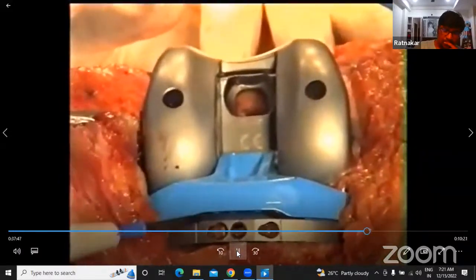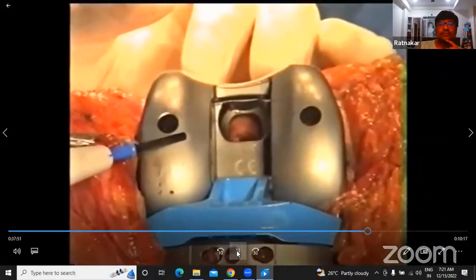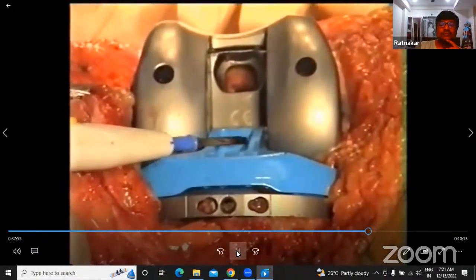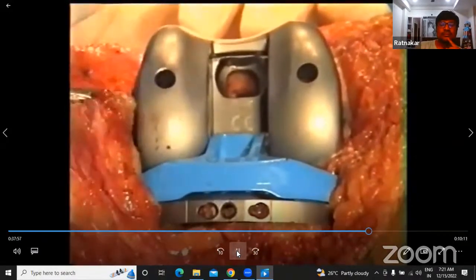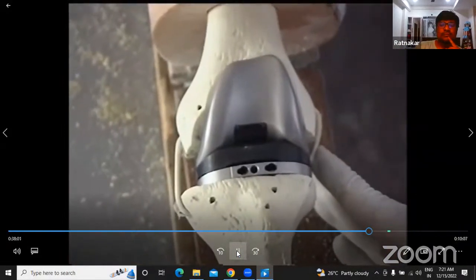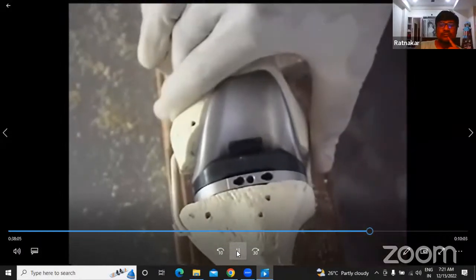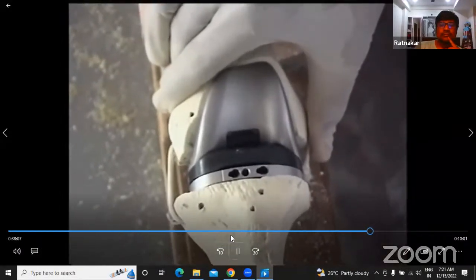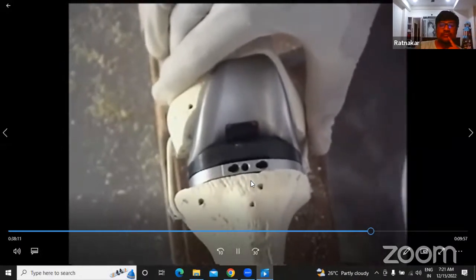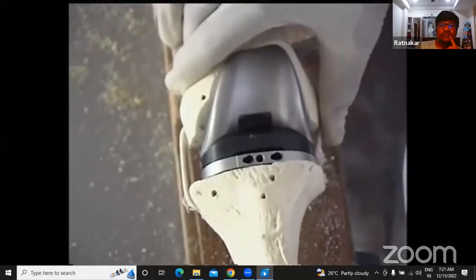Now we have applied the tibial trial, poly and the femur. The poly is 10 millimeter and this is a posterior stabilized. You can see this cam on the post mechanism. The trial implants are in and there are three criteria to see whether our knee replacement is right or not. Number one is in extension, there should be a relative 2 to 3 degrees of rock. Otherwise, it should be stable like that and it should not open that much.